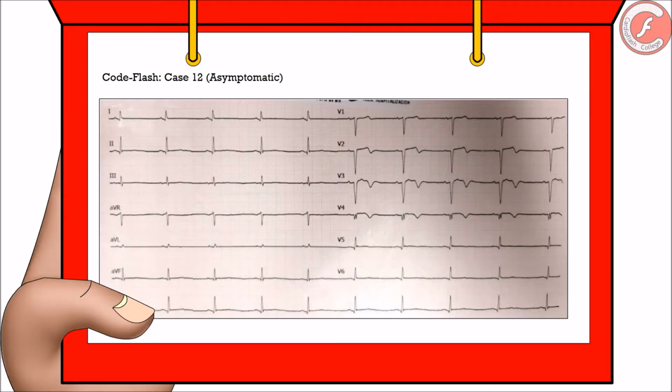In this way, with the artery open and with the technical problems of the stent corrected, the patient evolves favorably, reasons for which she is transferred to the hospitalization unit. In the control electrocardiogram, we can see the natural evolution of the disease because, as you see, the ST elevation has practically disappeared, the T waves have become negative, and the Q waves are still present.